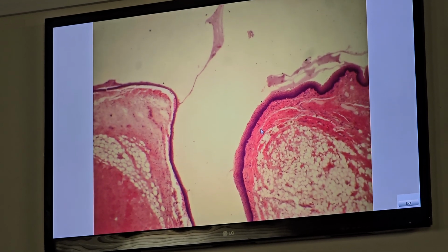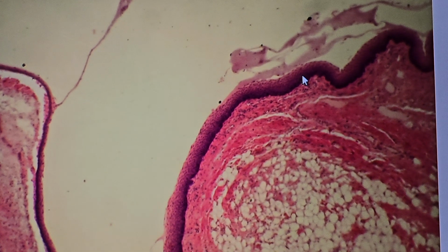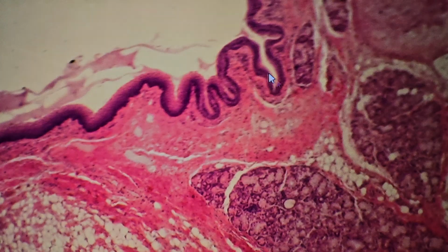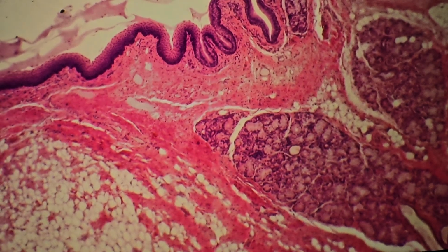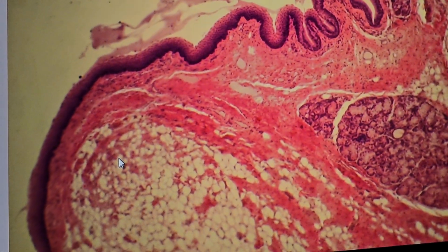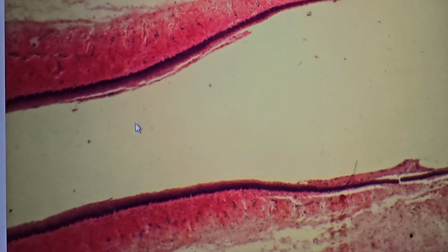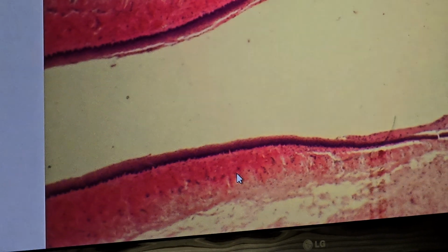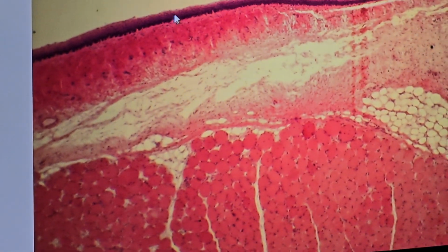This vestibular fold is covered partly by respiratory epithelium with areas of stratified squamous epithelium, with lamina propria containing seromucous glands. This is the upper fold. The lower fold, this is the lower pair, called the vocal cord or true vocal cord. It is covered by stratified squamous epithelium.